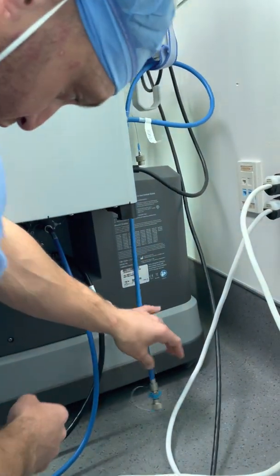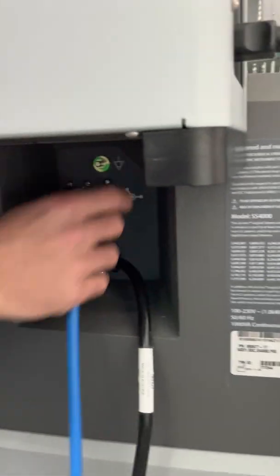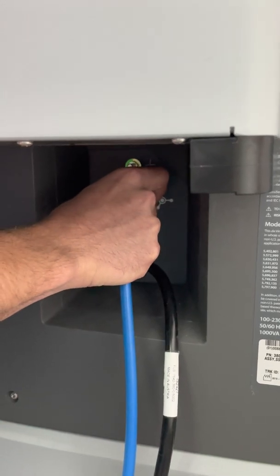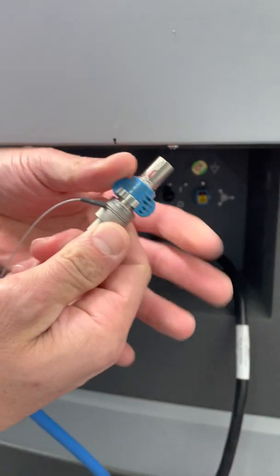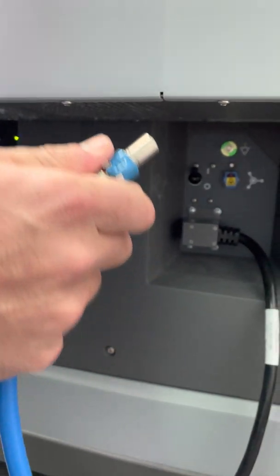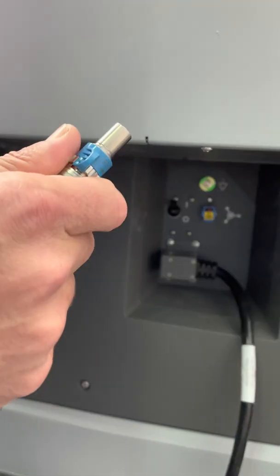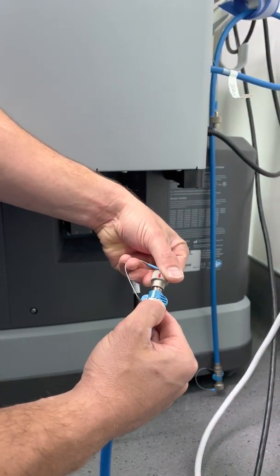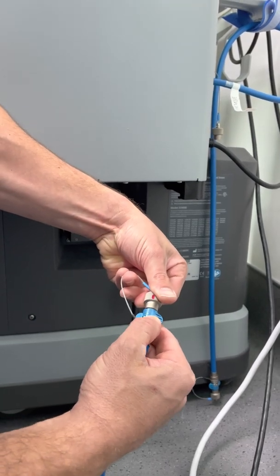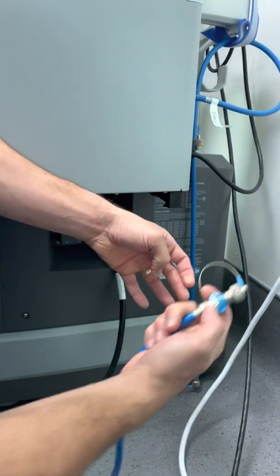First, unplug the blue fiber optic cable from the surging console. All you have to do is pull back on these blue tabs right here, or you could twist it. Don't yank it out — you could damage these really easily. These are $2,500 a piece, you don't want to break these. My suggestion when you take this out is to put this cap right back on it. All you need to do is realign the red lines and it'll click back on again.